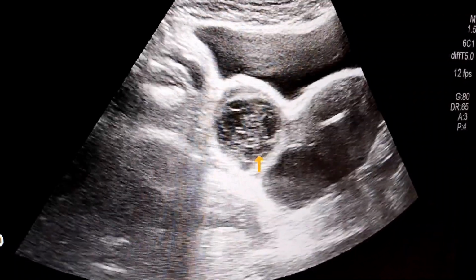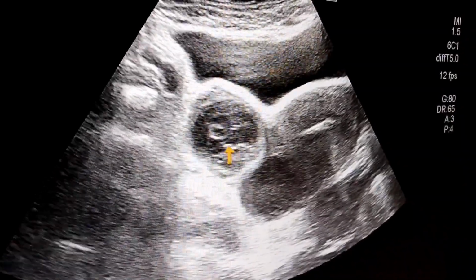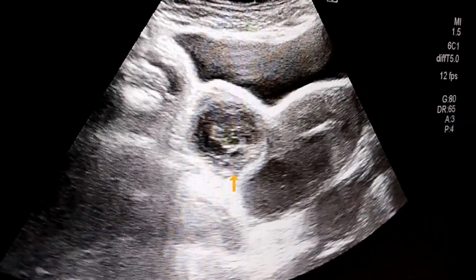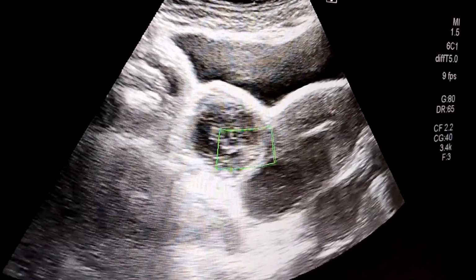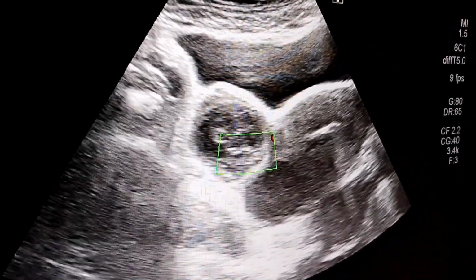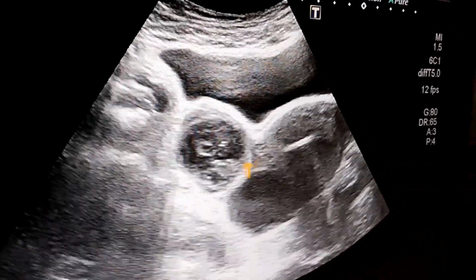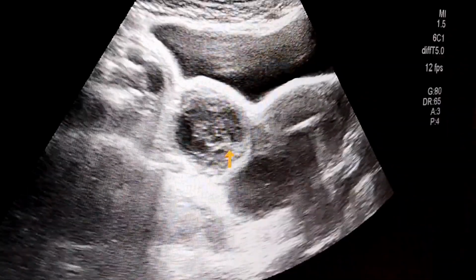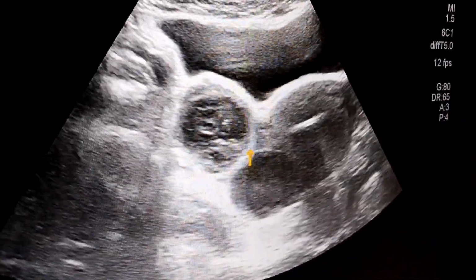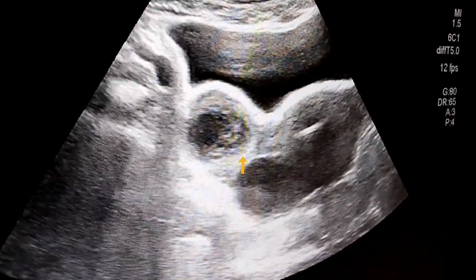And we can also appreciate this solid component in this. So we can say that this is a neoplasm, but when we put the color with the Doppler setting, we cannot appreciate any vascularity. So if we call it a mural nodule, this should give the vascularity. While there is no vascularity, so we can say that this is not the cystic neoplasm with mural nodule.